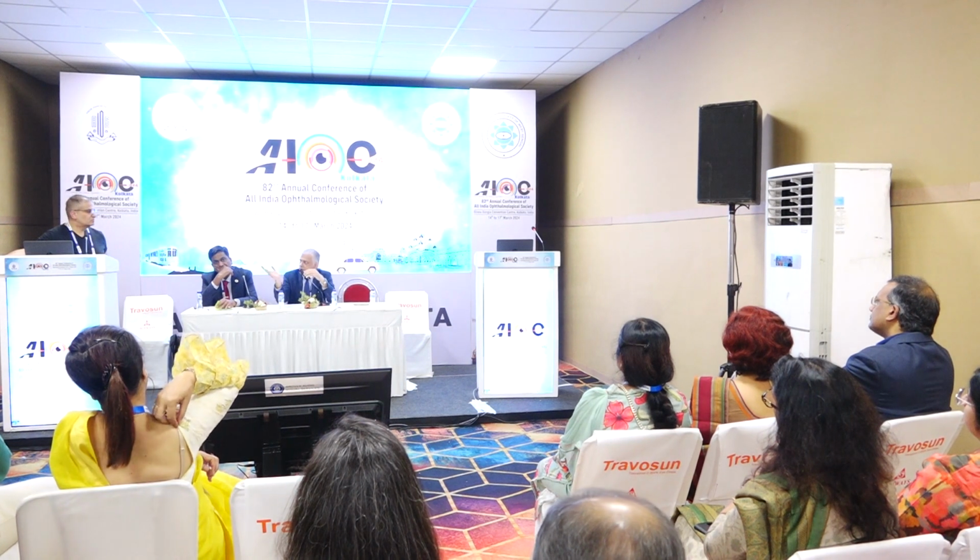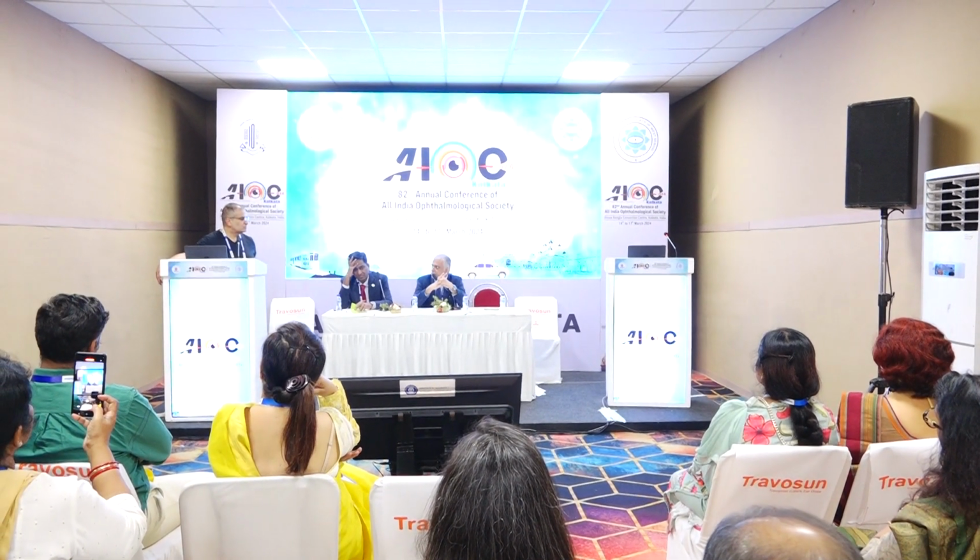The second major advantage which I have learned from Dr. Uday is toric IOLs. This is a game-changing platform for calculations on toric IOLs. Your thoughts on that? Yeah, obviously, treat the full refractive error, not just spherical. With IOL power, we just think of spherical, but we also need to think of toricity, of the astigmatism. Yes, that is also one of the areas where the calculation was always a challenge, and these kinds of formulas are going to give you a value add on that.